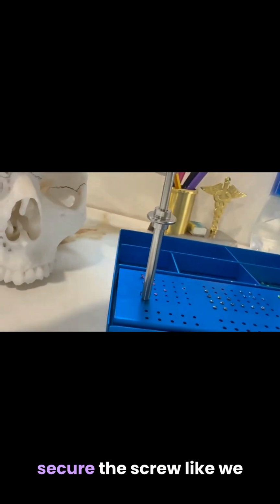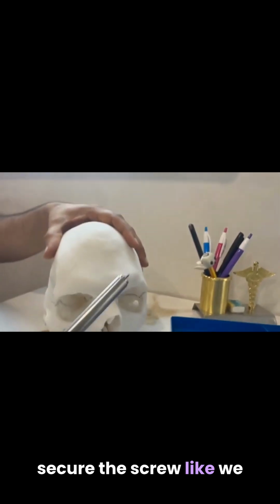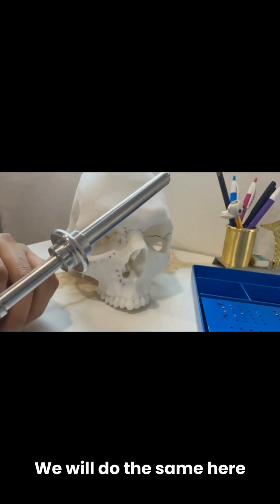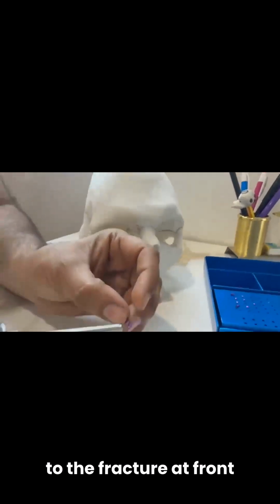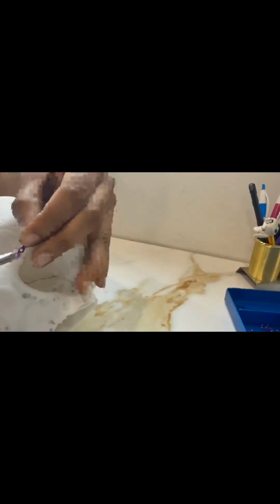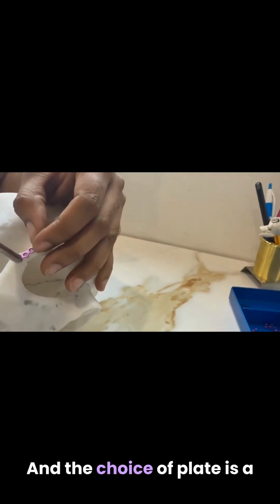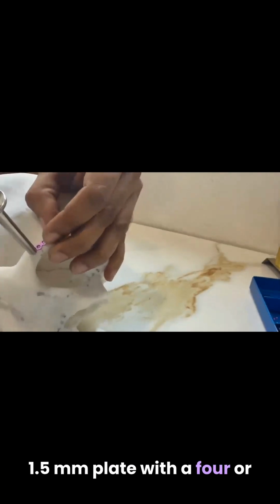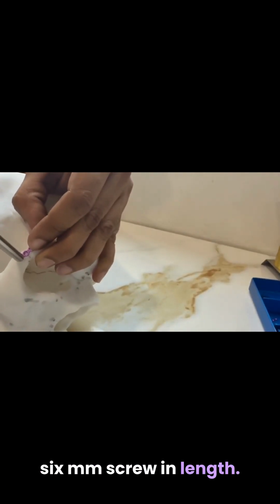We have to hold and secure the screw like we did in the previous series. We will do the same here, and this time we are going to the fracture at the frontozygomatic suture, and the choice of plate is a 1.5 mm plate with a 4 or 6 mm screw in length.